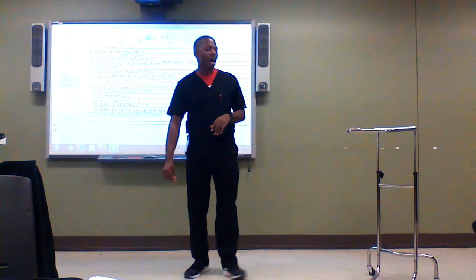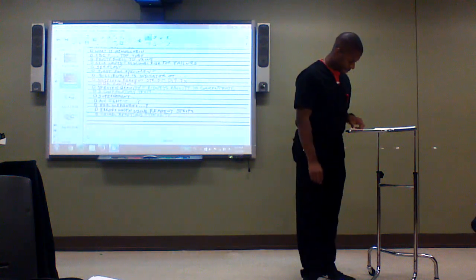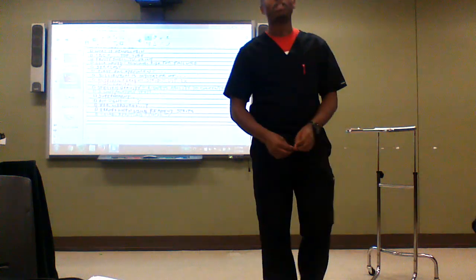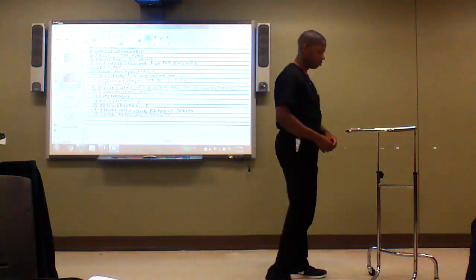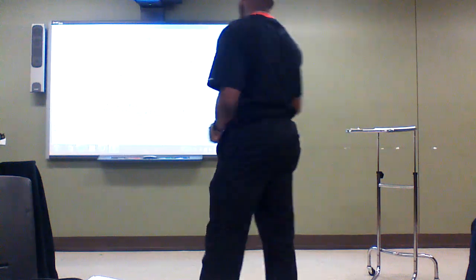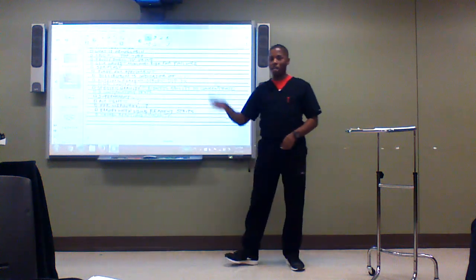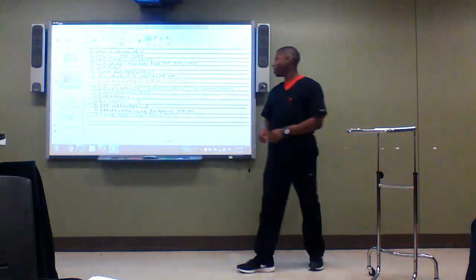What does ESR measure? How fast the red blood cells settle. That's exactly what I want you to remember. How fast the red blood cells settle to the bottom of the tube. That's what ESR is, erythrocyte sedimentation rate. I know y'all are ready to go home, but we have another slide to go through. So, not done yet.